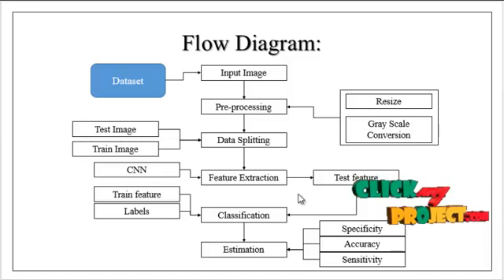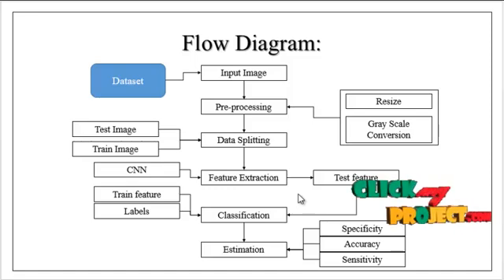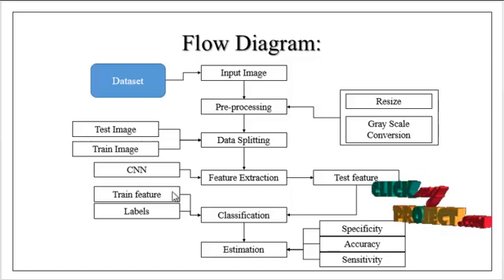For example, if I am extracting the features from the input, that will be considered as a test feature. In case we are extracting the features from the overall dataset, in the sense we have a trained model with the trained features.